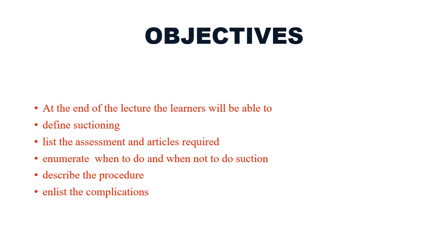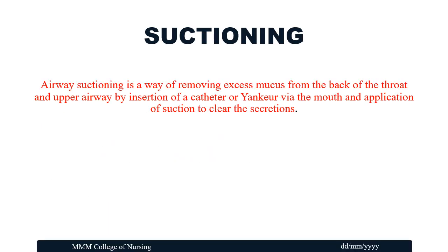Let's see what the objectives are. At the end of the lecture, the learners will be able to define what suctioning is, list the assessment and articles required, enumerate when to do and when not to do the suction, describe the procedure of oral suctioning, and also enlist the complications.